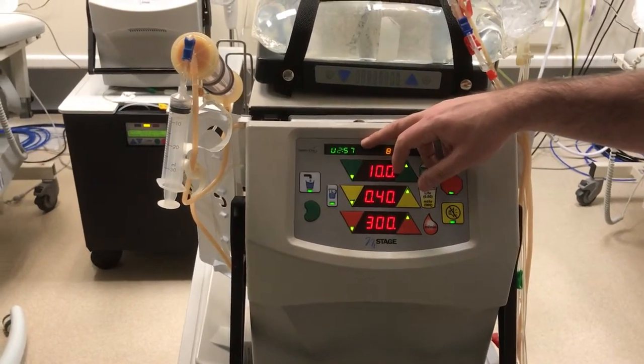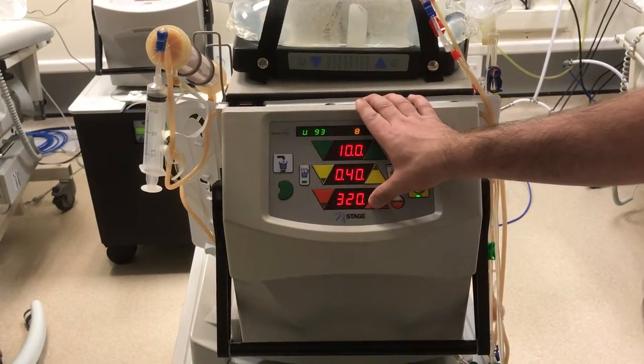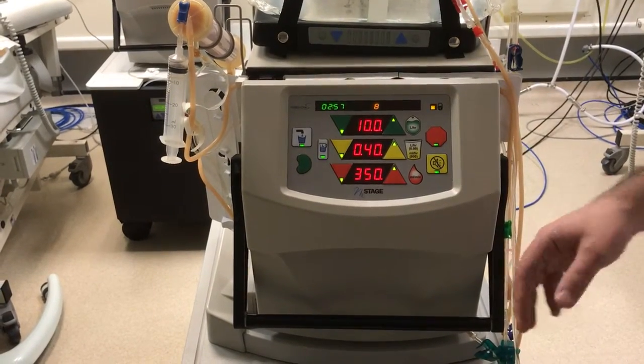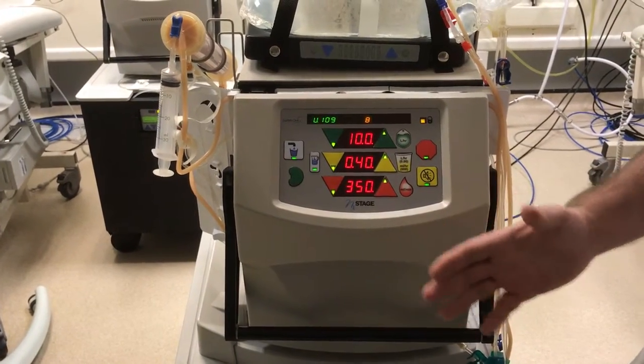Again we look at our venous pressure — as we can see it's still half of the blood flow, and today we're going to take it up to 350. This is the required flow that we want. You can see the arterial access pressure has come up and the venous pressure is well under half, so that's really very good.